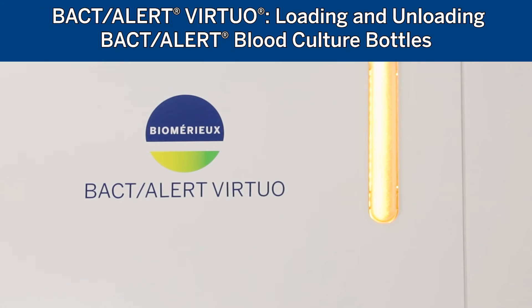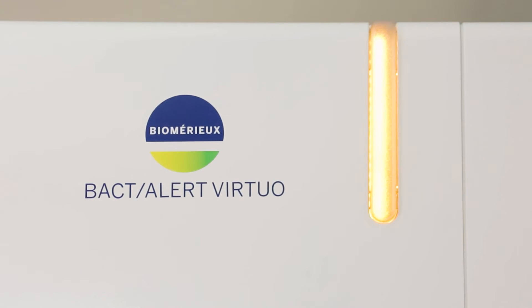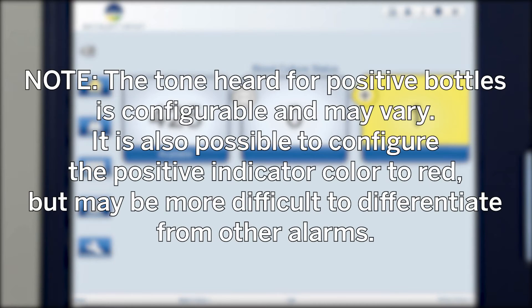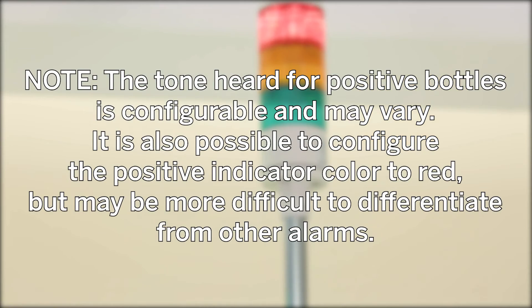Unloading bottles from the BactiAlert Virtuo system. When a bottle is determined positive by the instrument algorithm, the user will be alerted by blinking yellow lights on the system status indicator and warning light tower. The large display screen will display the number of positive bottles and an audible alarm will sound. Note: the tone heard for positive bottles is configurable and may vary. It is also possible to configure the positive indicator color to red, but this may be more difficult to differentiate from other alarms.